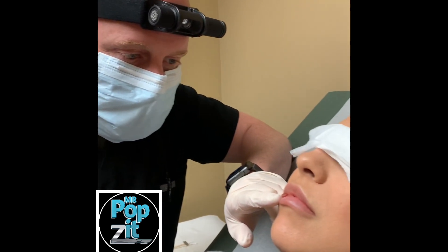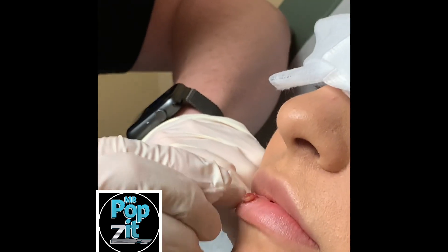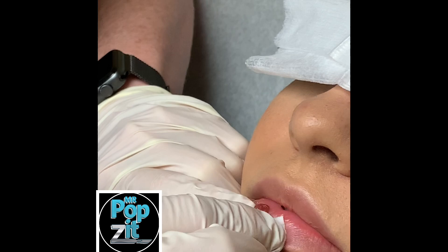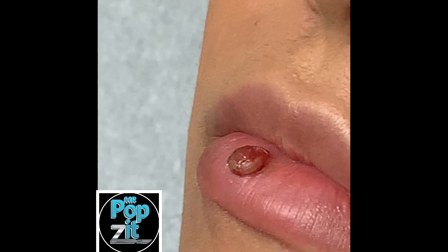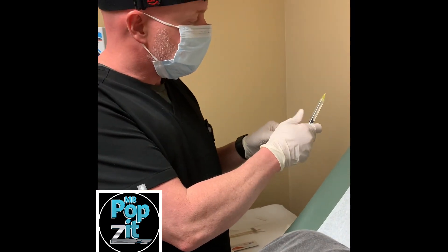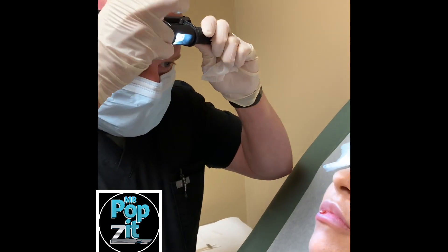You can see here it's called a pyogenic granuloma, usually from a mild trauma. These are a small vessel that gets inflamed and it makes this vascular growth that is what's called friable — it bleeds very easily. So we do a little bit of numbing and we shave that off and cauterize that vessel. We're going to do that today.